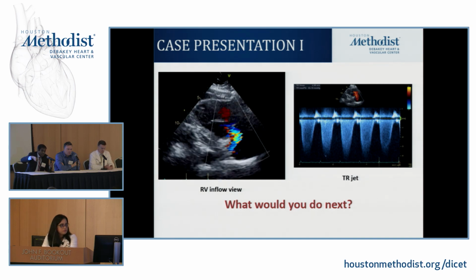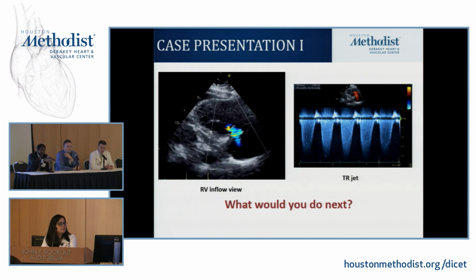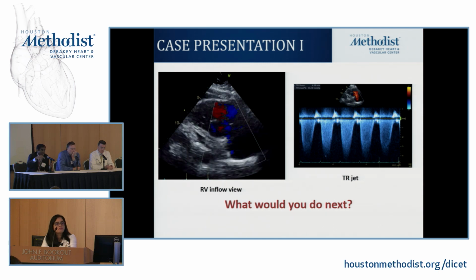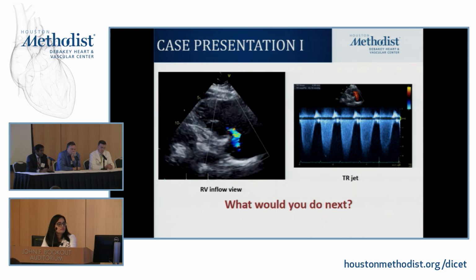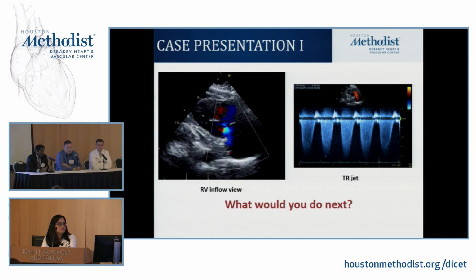especially if it's a peripheral ECMO, the blood's going into the RV and then through the PA. I'm not sure how much is going back into the LV. It looks like an acute PE echo. The echo looks almost like there's no blood going into the LV. But that's a high resistance in my mind, because if someone has RV failure and you put them on ECMO, you would expect some amount of decompression, unless it's an acute process. I'll let Dr. MacGillivray finish up here because I'm sure he knows the answer.